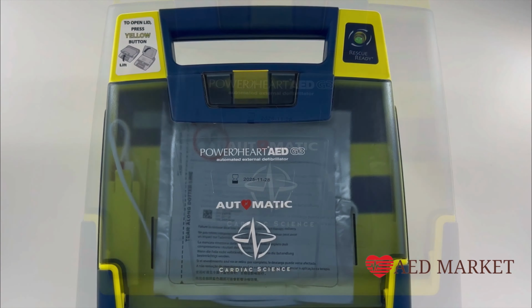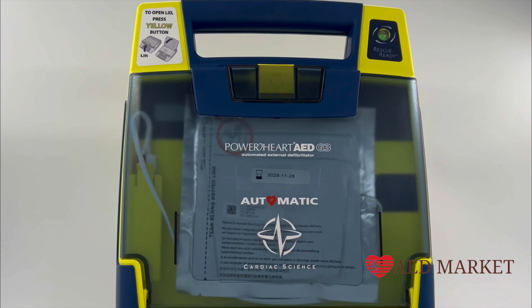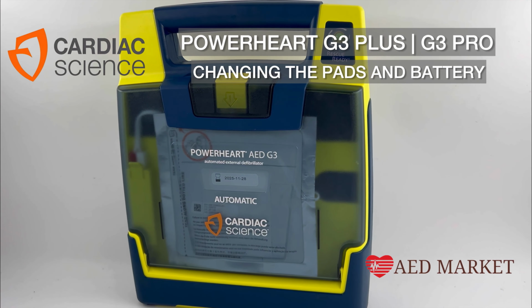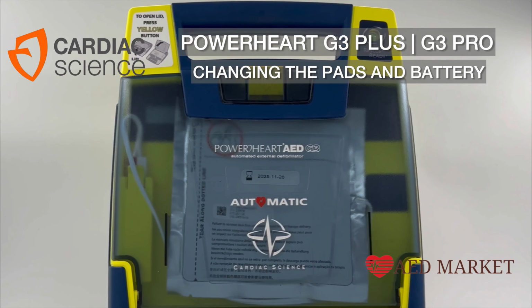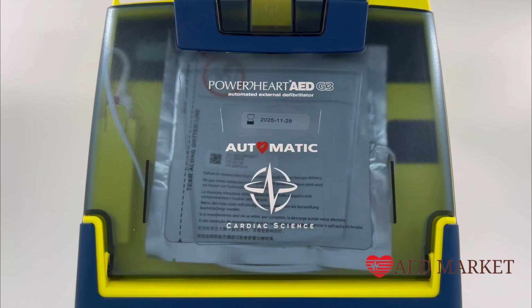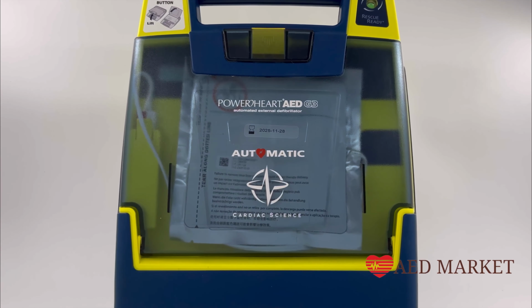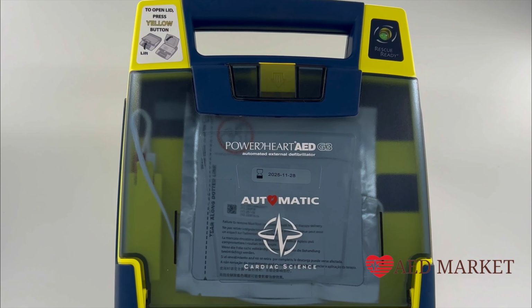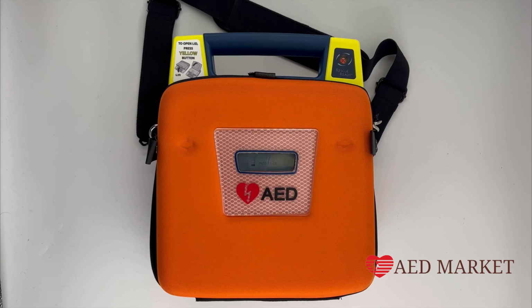This video is presented by AEDmarket.com, and today we're going to guide you through the steps to change both the pads and battery in the Cardiac Science PowerHeart G3 Plus and G3 Pro AEDs. It's important to note that the procedures for changing pads and batteries are identical for both of these AED units, with our primary demonstration being focused on the G3 Plus.